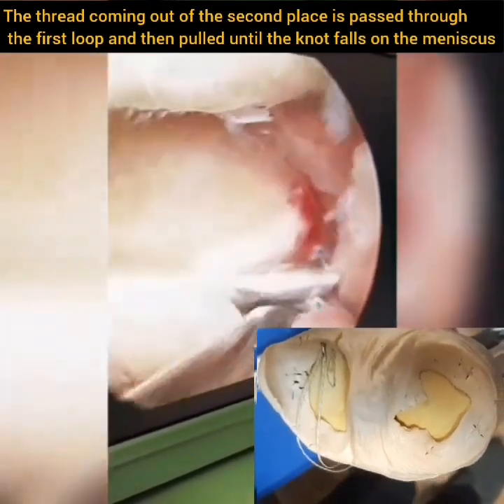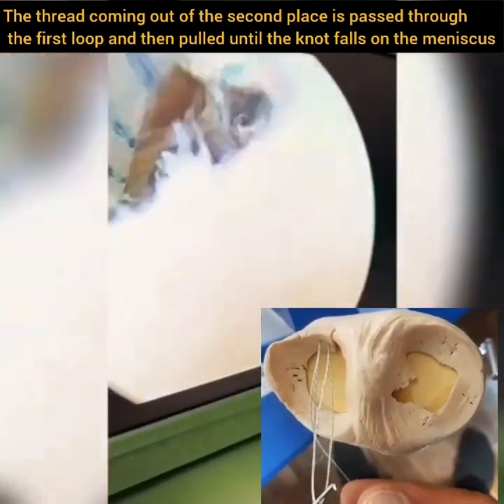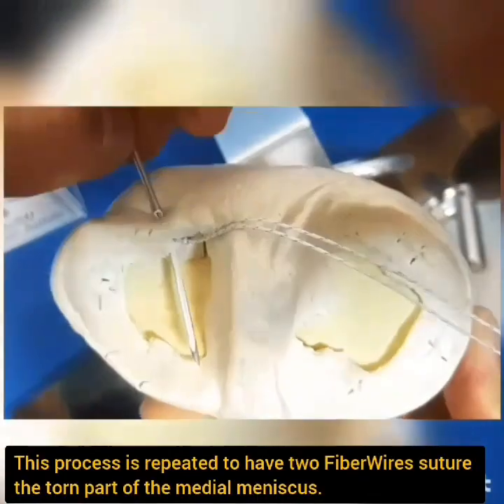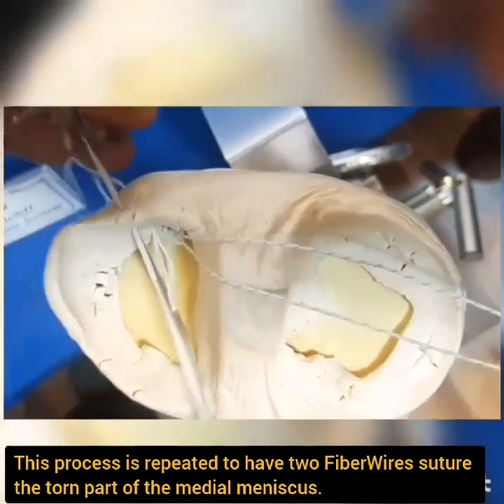The thread coming out of the second place is passed through the first loop and then pulled until the knot falls on the meniscus. The fiber wire is passed a second time through the torn part. This process is repeated to have two fiber wires suture the torn part of the medial meniscus.